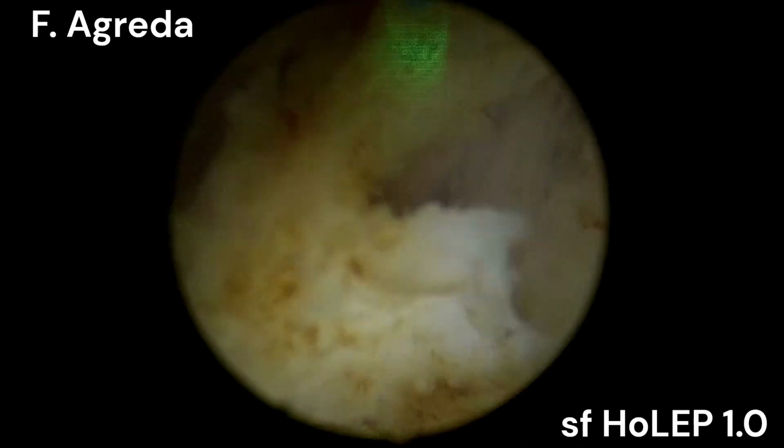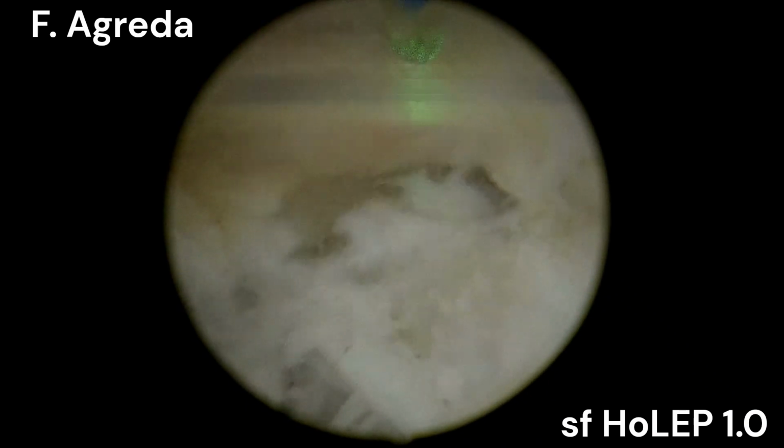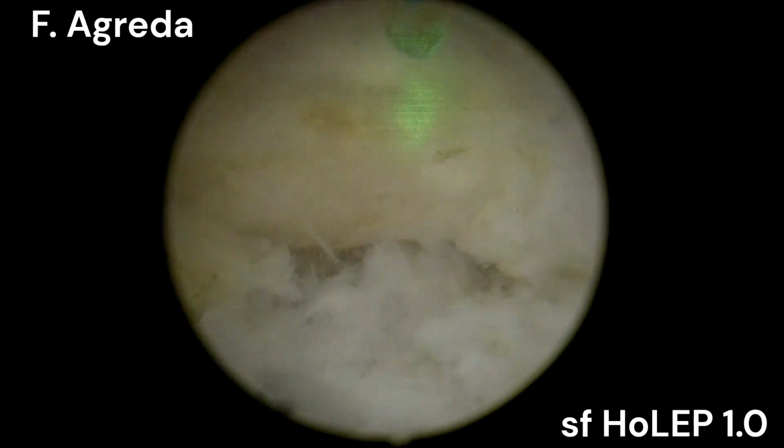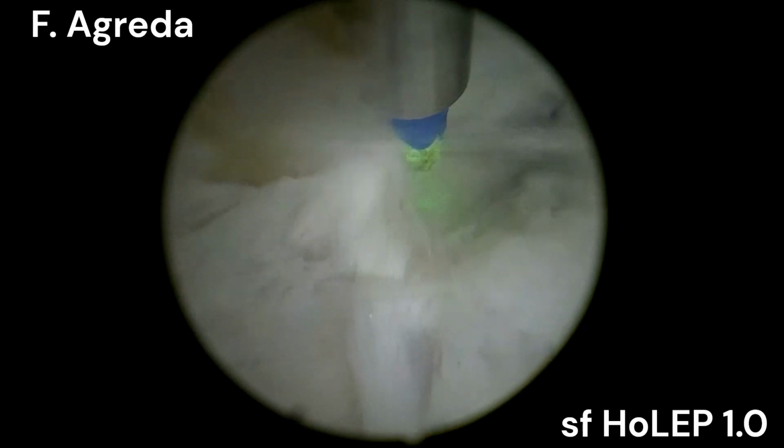I've done some HoLEP after embolization, and I've seen that material in some, I will say, arteries. They are supposed to be arteries in the adenoma and in the capsule when I'm performing the enucleation.